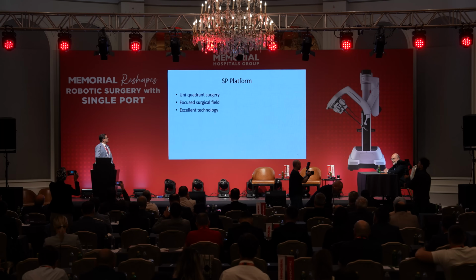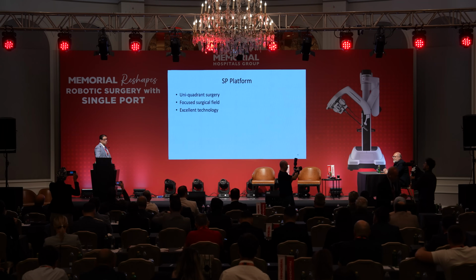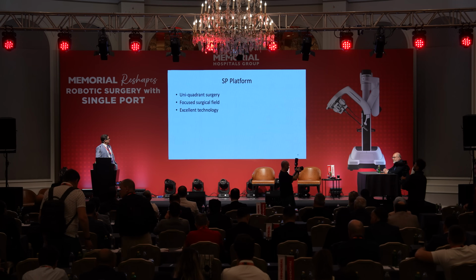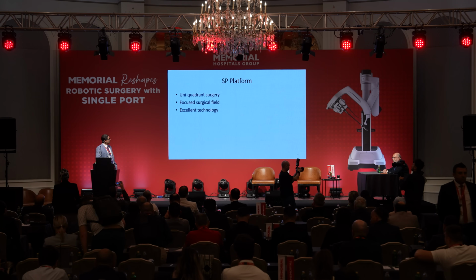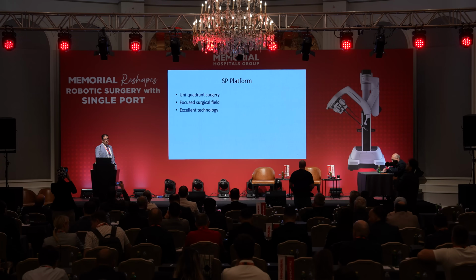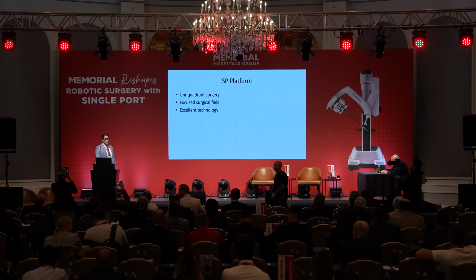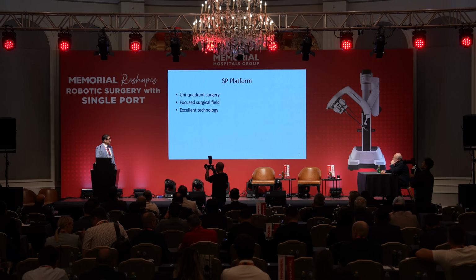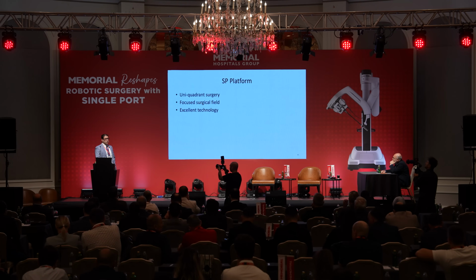So what's different in this platform in all these specialties as opposed to colorectal? It is perfect for uniquadrant surgery. It is a very focused surgical field. Therefore, you have to understand the ergonomics and the dynamics, how to use it to go into different places. And the technology is excellent once you know how to implement it and how to drive it.